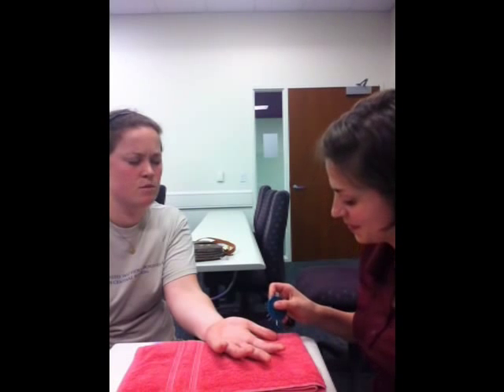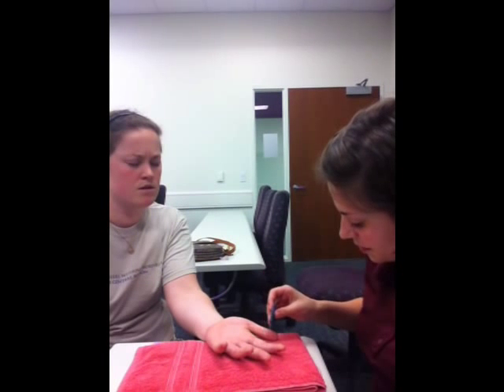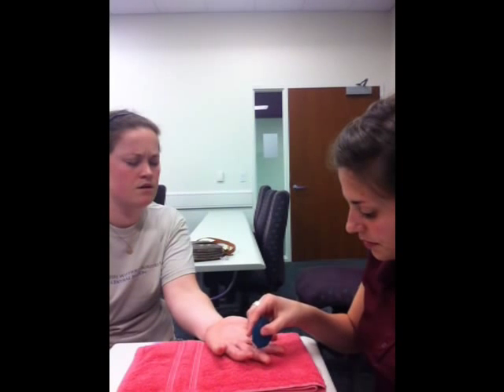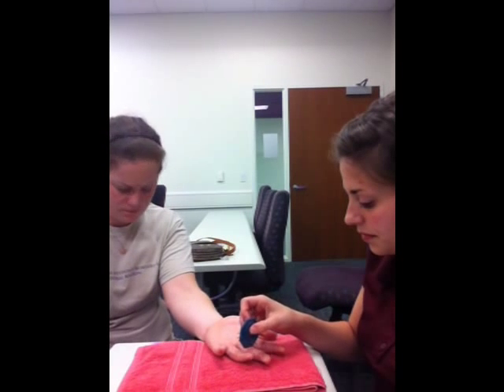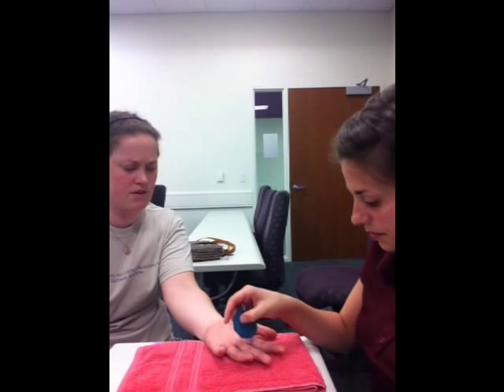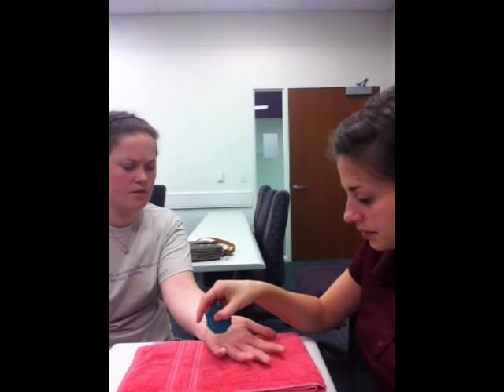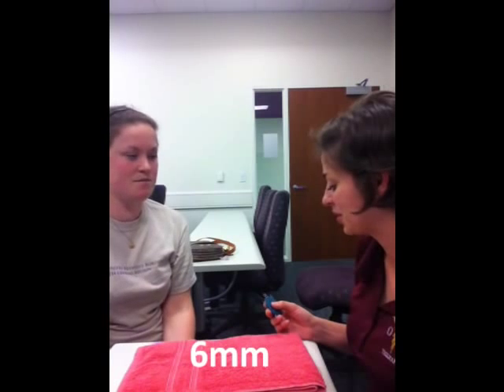One, two, one, two, one, two. Two, two, one, one, one, two, two, one, two, one, two, two, one. So we were able to distinguish that as well. And we're going to move on to the next one.